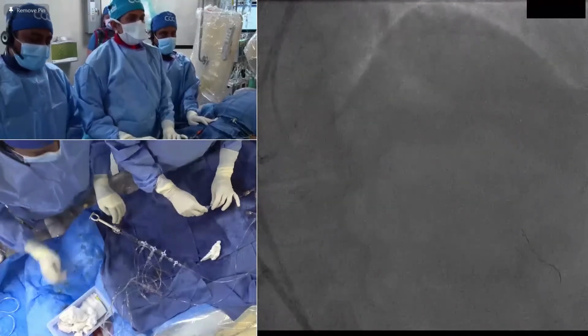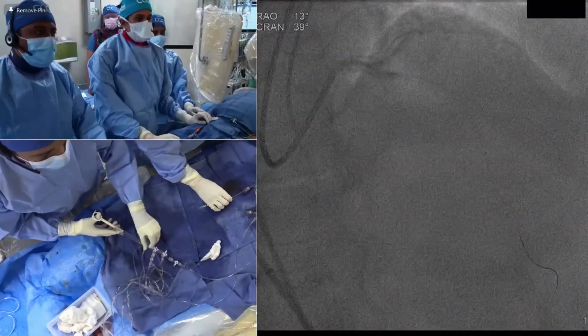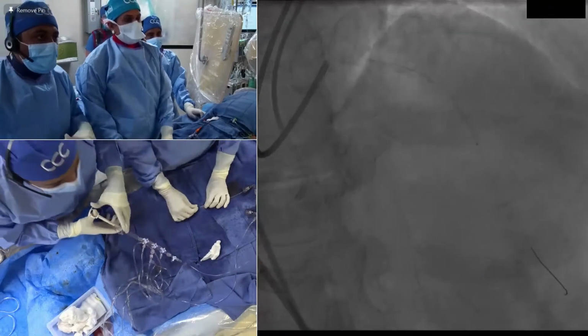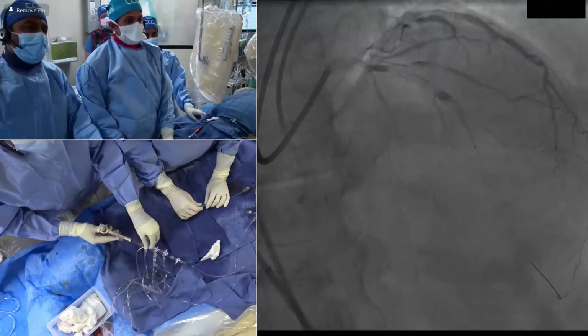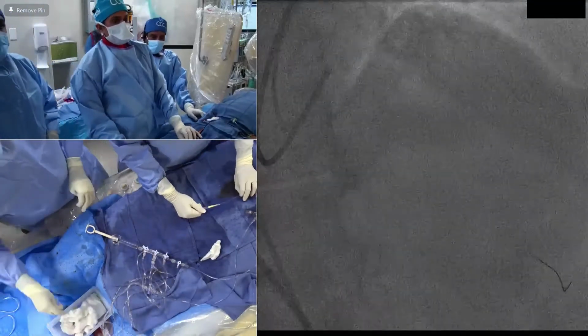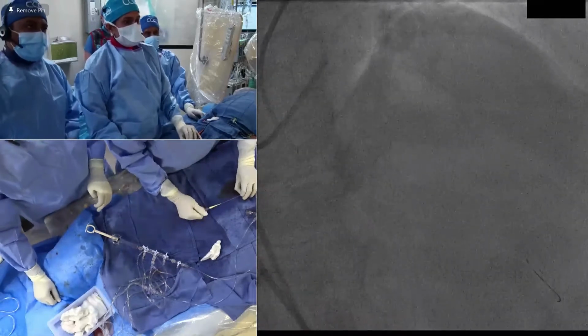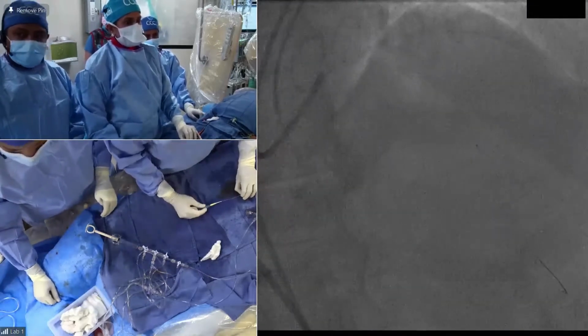Turnpike, Teleport. There are several catheters available, and like we mentioned, whatever you are comfortable with. I think a Rotawire may go now, right? Yeah, Rotawire will go. Okay, let's get the Rotawire. What size burr though? First one is 1.25, approximately 1.75 later.